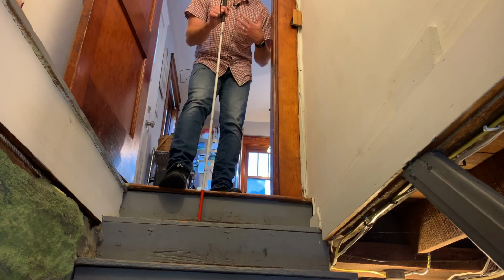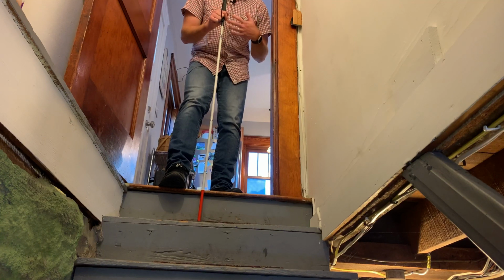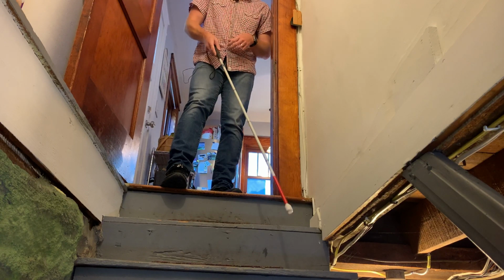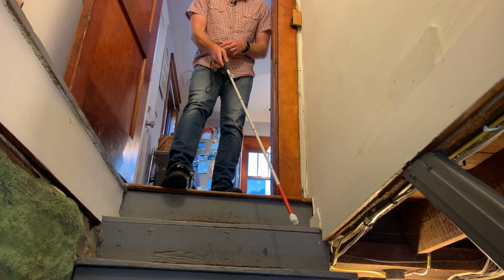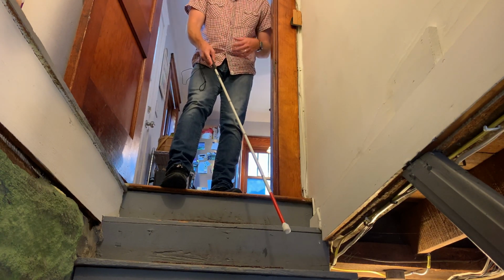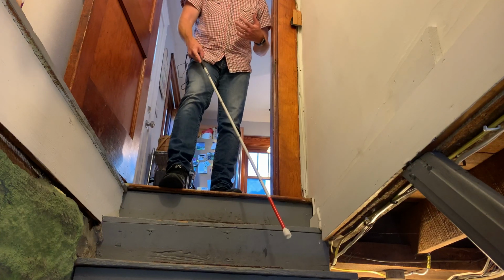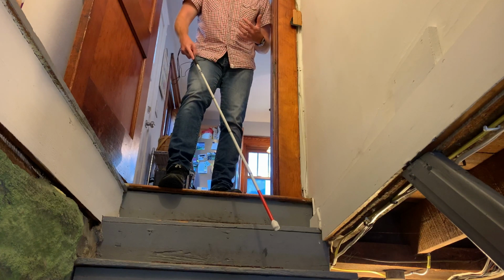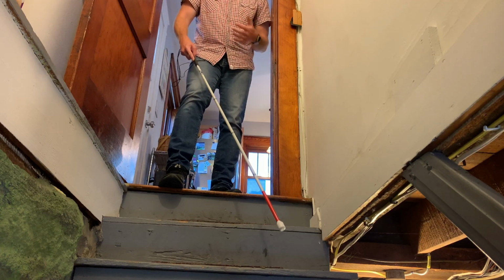All right, so now for step 4, after you've established all that, you're gonna wanna get the cane back into index finger grip. So I'm doing that now. So my index finger is extended along the flat part of the grip. And you're gonna get into diagonal cane technique. So that is where the cane is diagonal across the body. That way it gives you full protection of the width of your body.